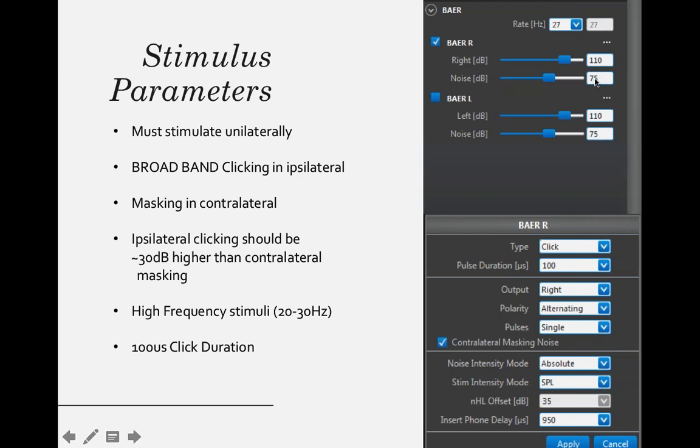Every patient is a little different. Sometimes the stimulating kits are a little bit different. So just like with your stimulation for SSEPs and for MEPs and for triggered EMGs, you want to do it on a case-by-case basis, and you fine-tune it during the procedure to make sure you are getting the kinds of signals that you need.